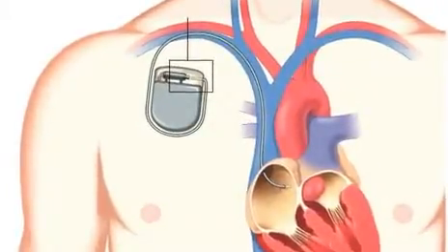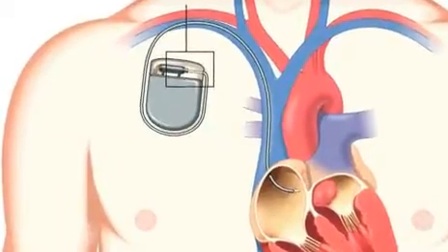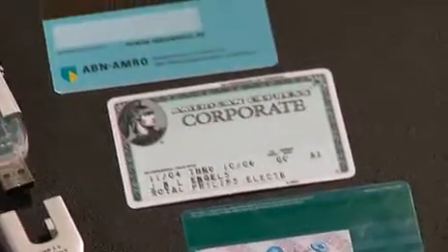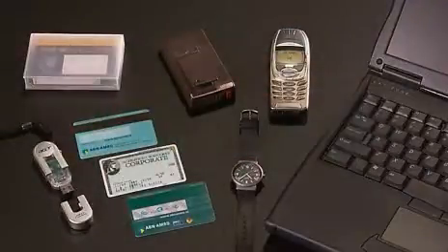The magnetic field can also affect the operation of magnetically sensitive active implants, such as pacemakers. And remember that the magnetic field can damage watches and erase magnetic data carriers, including credit cards.